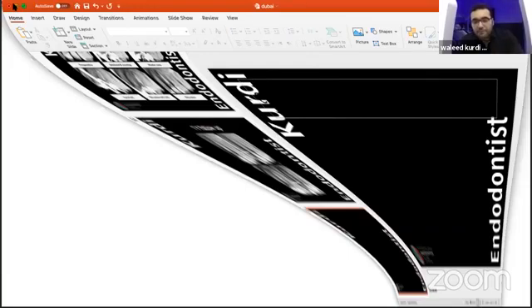If the file is separated in the outer wall, it's relatively easy to bypass in a curvature. What if the file separated in an inner curve? There is more chance for ledging during bypassing. Indeed. Please explain the bypass of an instrument in an inner curve.